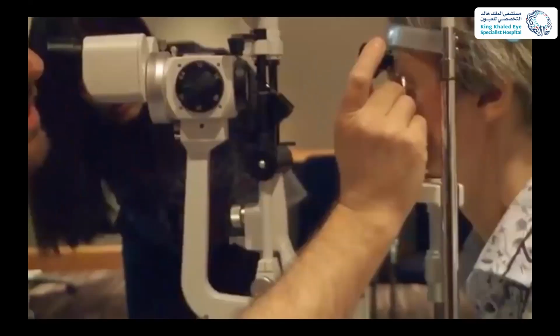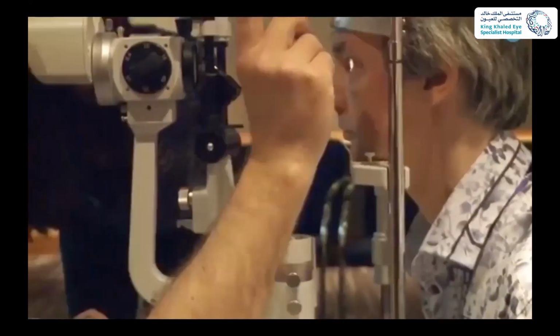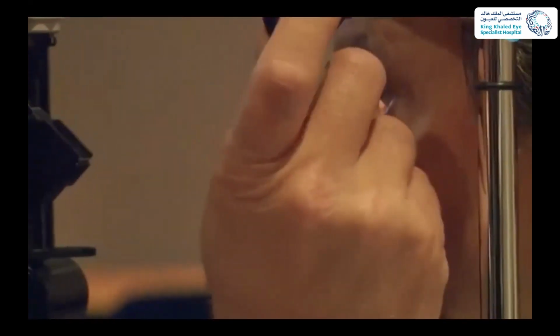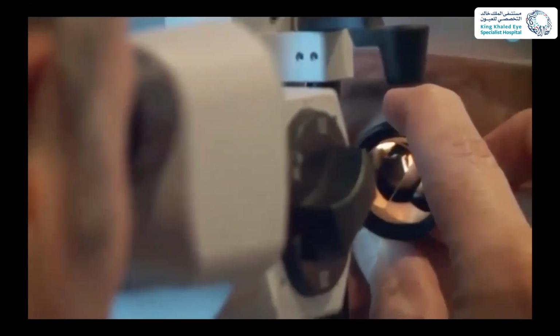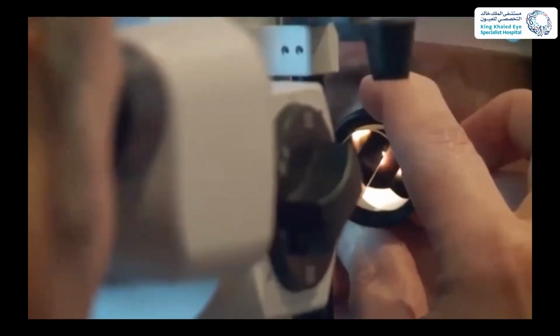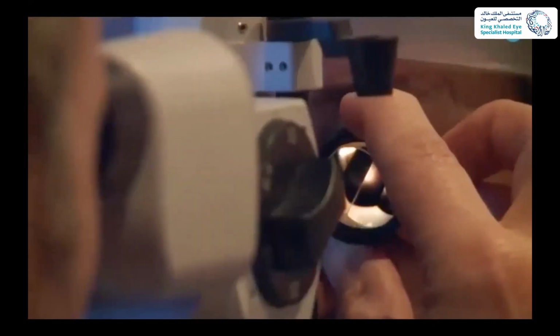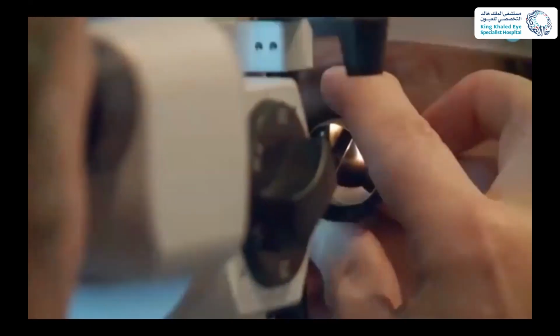So there are then different ways of inserting the lens, and no way is necessarily better than the other. But what I tend to do is use my ring finger to hold the lower lid, ask them to look up, angulate the lens towards the eye, and then here I've got the angulated beam, and you're looking for the beam from the side on. And then what you see is basically brown iris and then white sclera above it. And sometimes you see some brown lines along that.